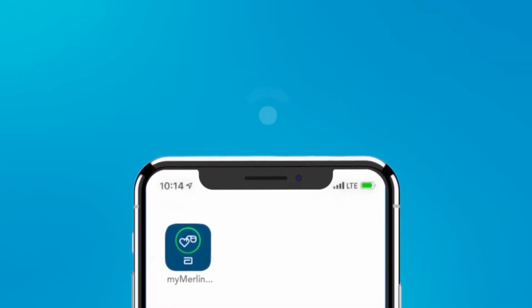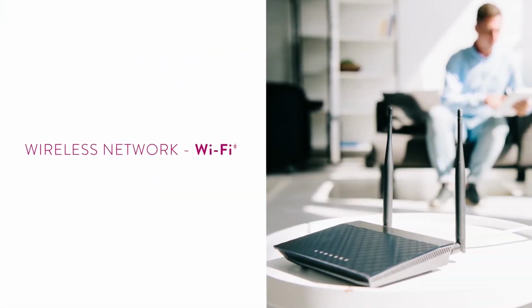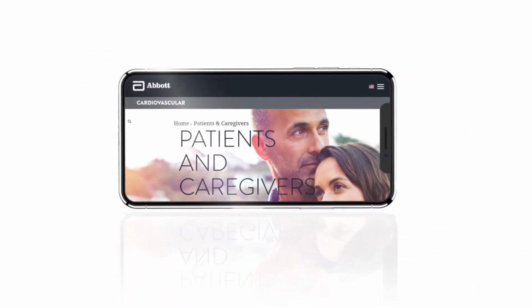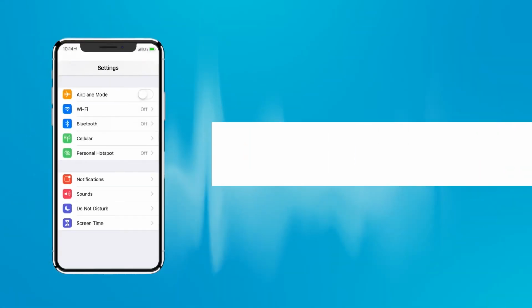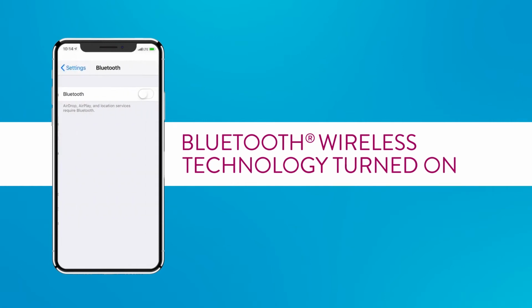You have two options for internet. You can use a wireless network, commonly referred to as Wi-Fi, or you can use a cellular data plan. If you are unsure whether or not you have a good internet connection, try to visit your favorite website on your iPhone. To pair your Abbott device to your smartphone, you must have Bluetooth wireless technology turned on within your settings menu. You are now ready to pair your device with your app.